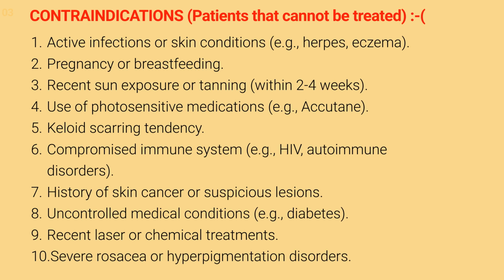Diabetes, hypertension, or other uncontrolled chronic conditions that affect wound healing can increase the risk of complications. Recent laser or chemical treatments. If a patient has recently undergone other laser treatments, chemical peels, or dermabrasion in the same area, the skin may be more vulnerable and should be allowed to fully heal before proceeding.